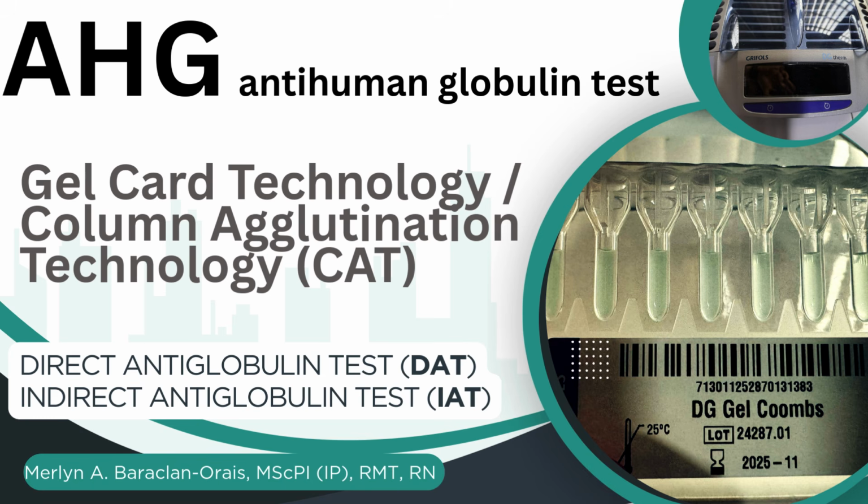And then moving on to gel card technology, also known as your column agglutination technology, or CAT. This innovative method utilizes gel particles to separate and identify the presence of antibodies. And through centrifugation, red blood cells interact with the gel, making it easier to detect agglutination results.